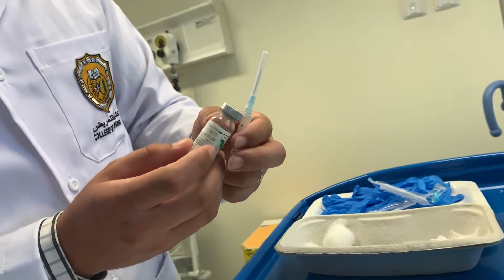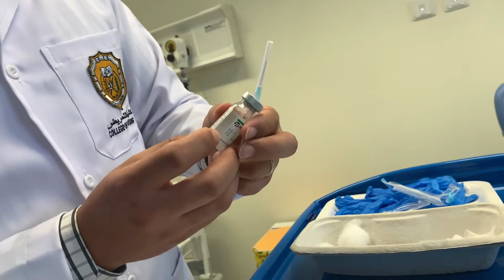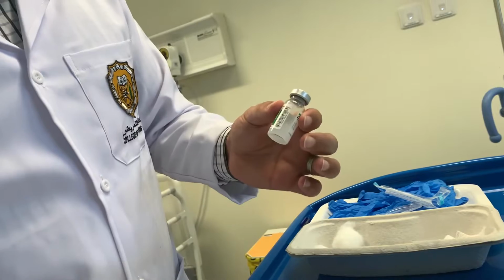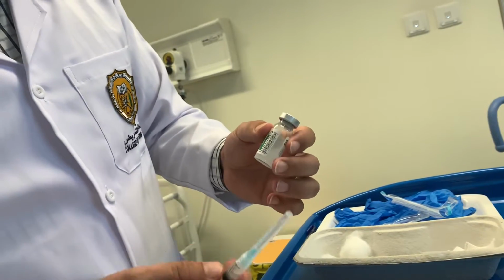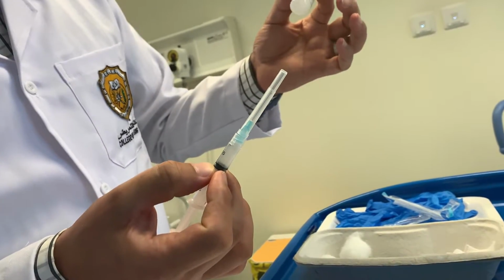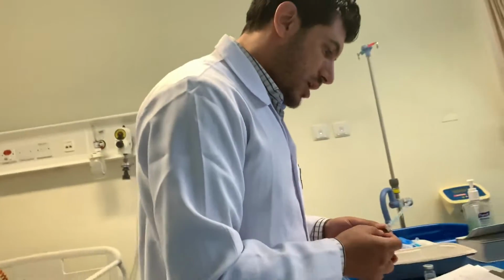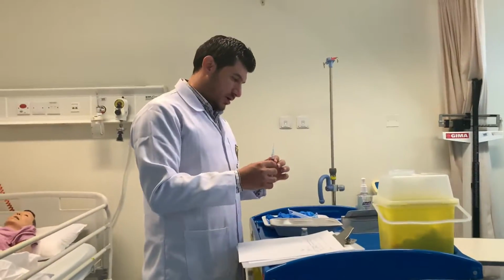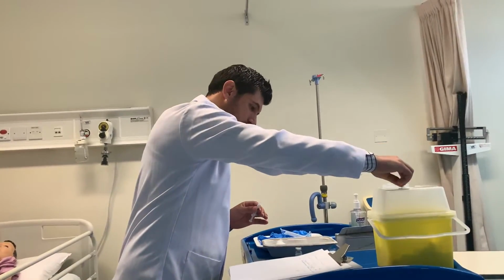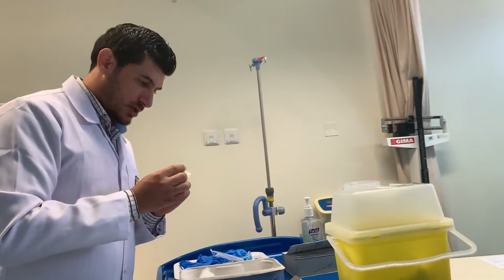It was opened 2 days ago and its expiry date is May 22, 2022, and the desired dose is 5,000 international unit, which is equal to 1 ml, and this is 1 ml of the 25,000 international unit, so it is 5,000. It's the right drug, right dose, yes. Thank you. So we verify that it is the right drug and right dose. So now we need to change the needle to a smaller one to be appropriate for the subcutaneous injection.